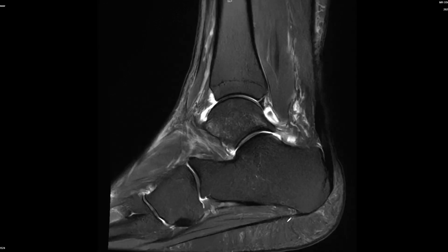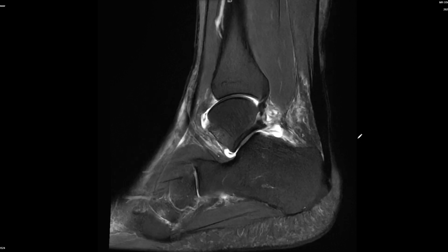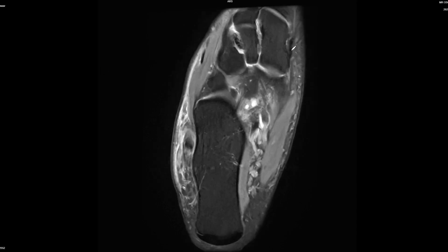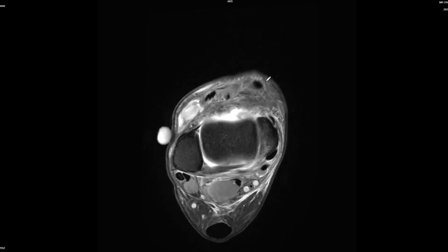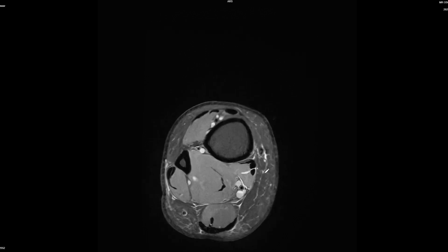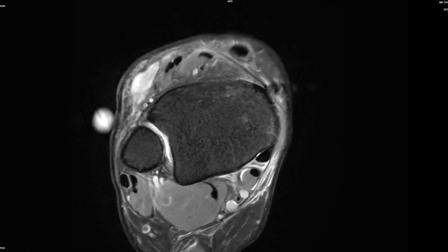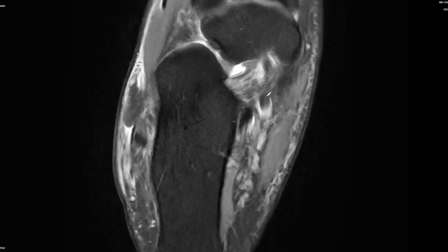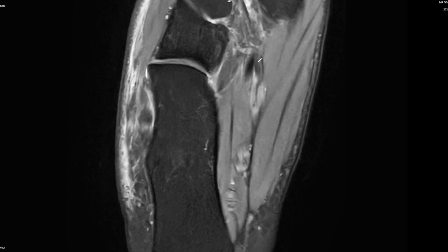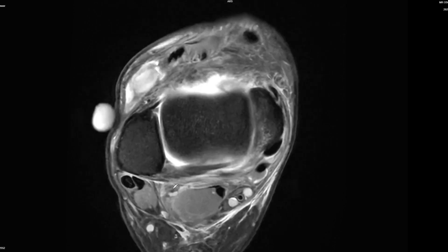Moving on to the tendons: the plantar aponeurosis is fine. The Achilles tendon shows a little bit of thickening, so there's mild tendinosis. The extensor tendons - the distal tibialis anterior tendon insertion is fine and the other extensor tendons look okay. There is a little bit of fluid or hemorrhage into the tendon sheath of the posterior tibial tendon, whereas the flexor digitorum longus and flexor hallucis longus are unremarkable.